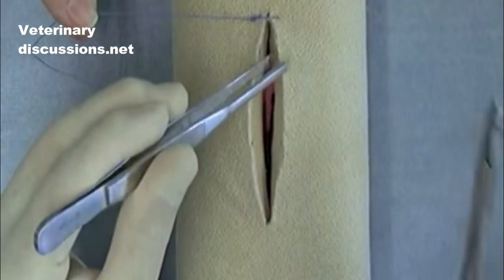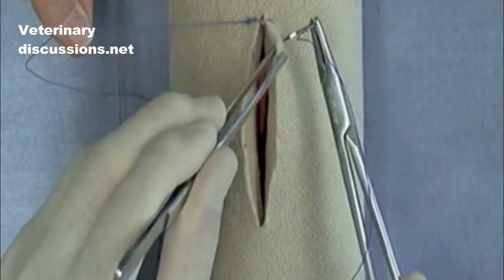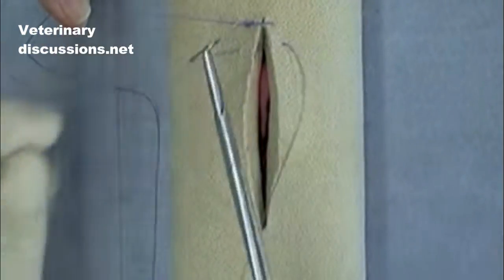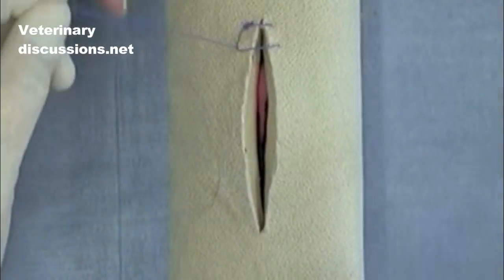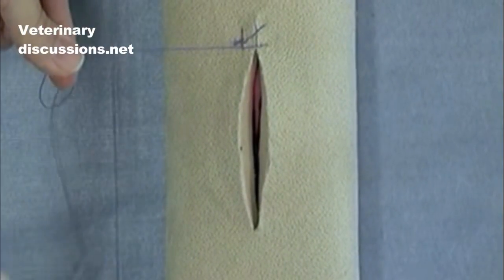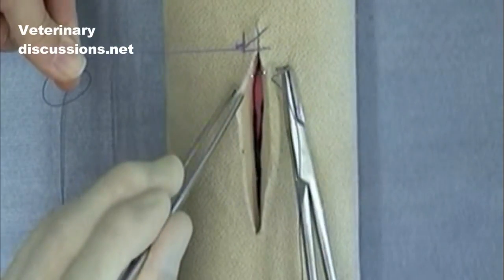The pattern is done by continuously performing simple interrupted bites, but you can see I'm coming inside the loop of my suture. As that's pulled down, you can see there's going to be very even distribution of tension on the suture line.